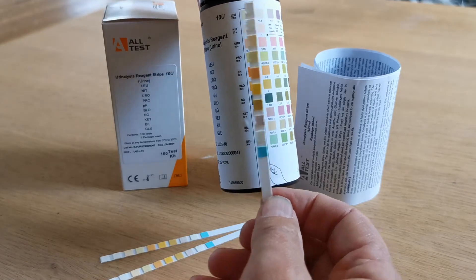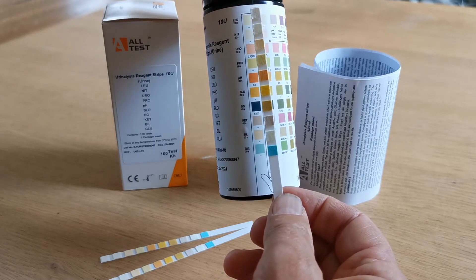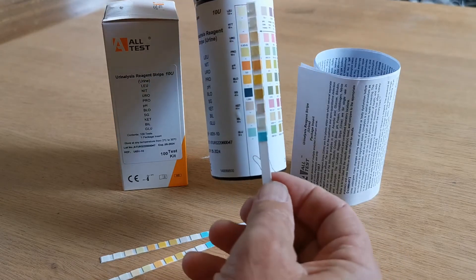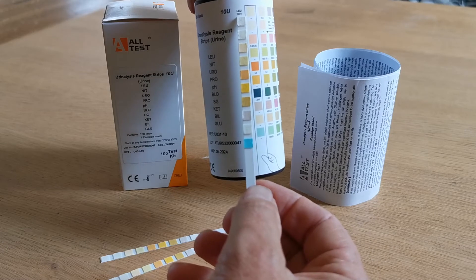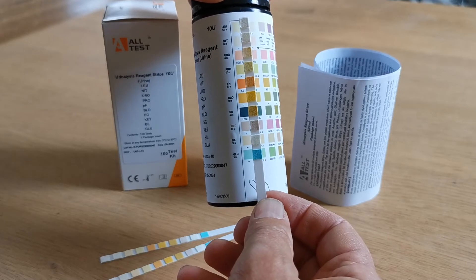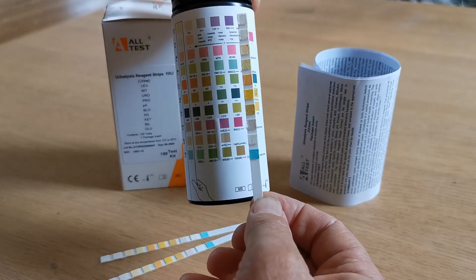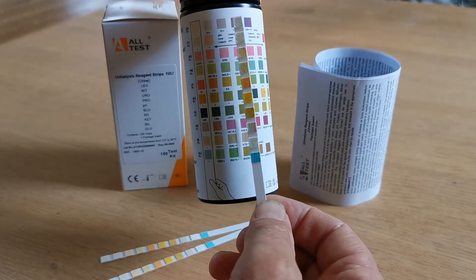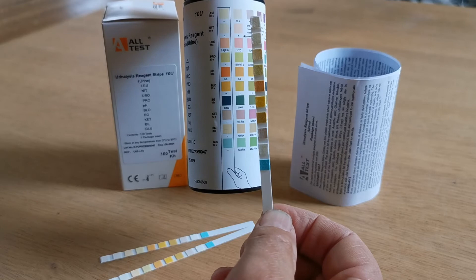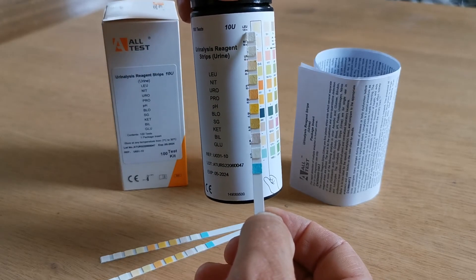An all-negative test will correspond with the colour pads after it has been dipped in the urine — please note, after it has been dipped in the urine, not necessarily when it is dry — with this column on the left-hand side. So if at the specific read times, which are listed next to each of these parameters, all the colour pads correspond with the colour matches in this left-hand column, your test is all normal. If they don't correspond, then you match them against the closest match going along these rows, and against each of these is a level for the result to be interpreted.